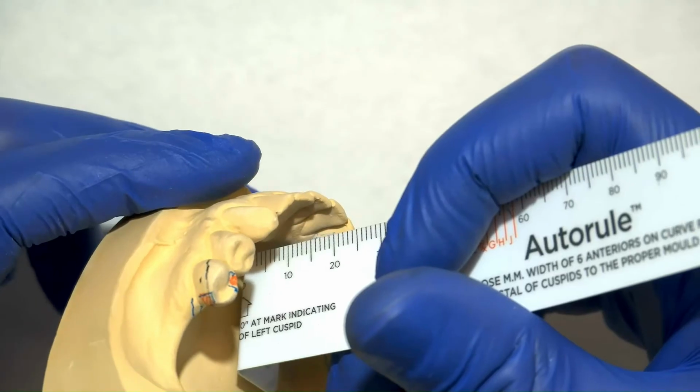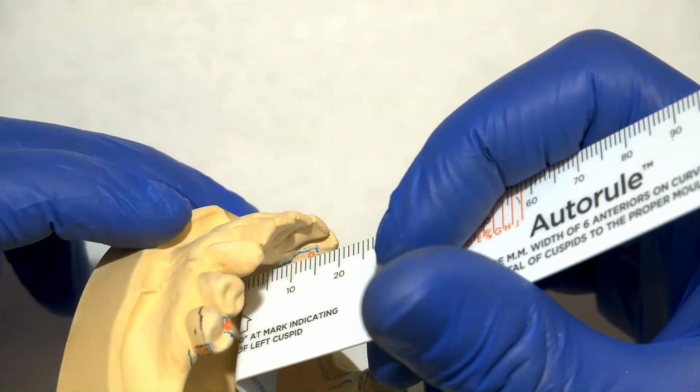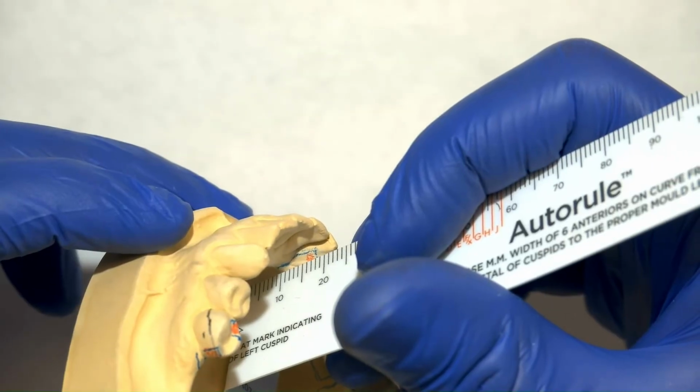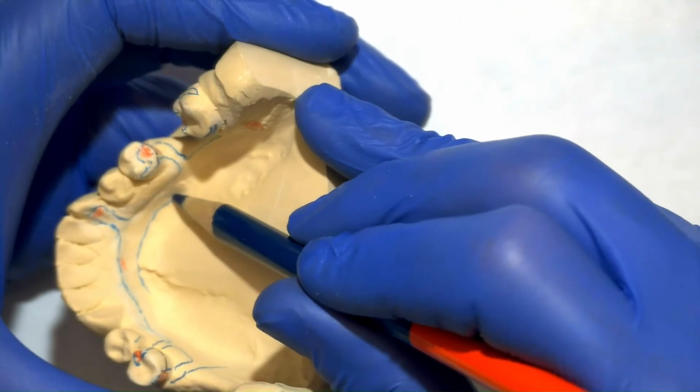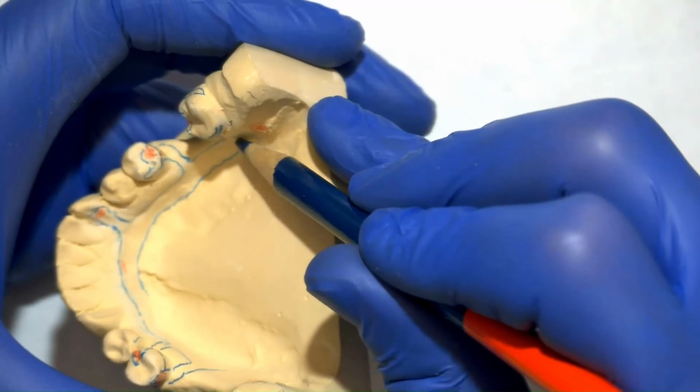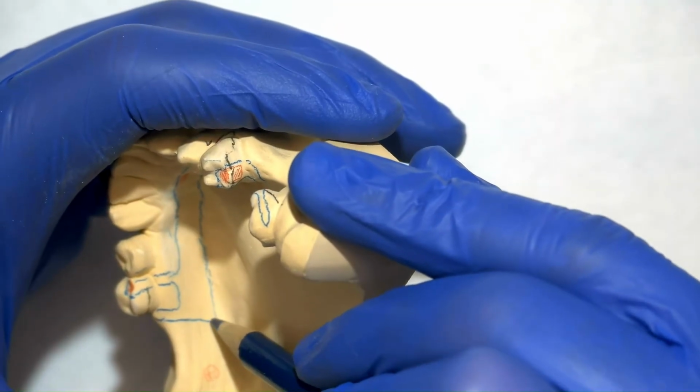So we need to measure this, make sure we have enough space. The bar itself needs to be 5 millimeters thick, and we need about 3 millimeters between the edge of the bar and the free gingival margin. Make sure to measure that in the patient's mouth. This is supposed to be the active floor of the mouth, not just on the cast. But once you've done measuring, go ahead and draw your bar.